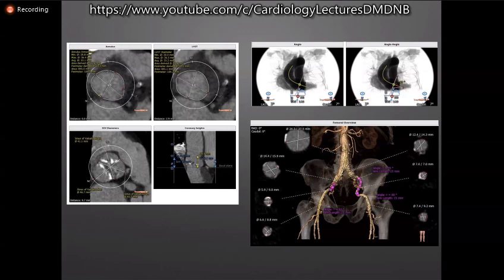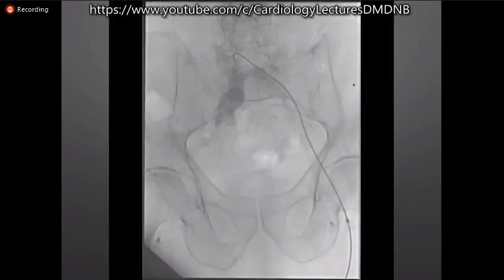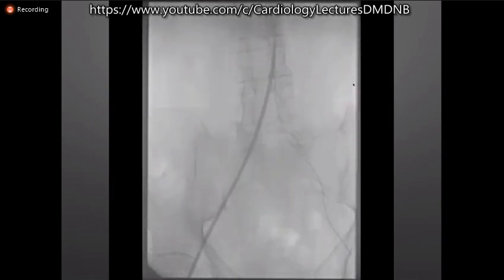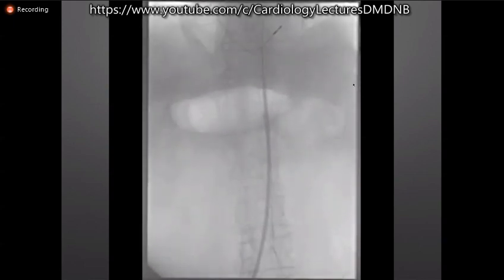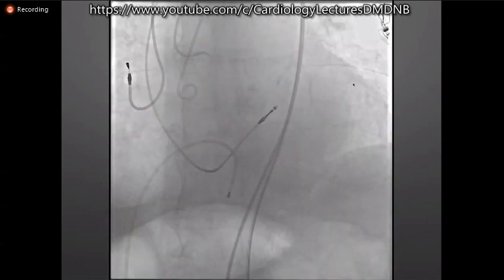Regarding access, there were some aneurysms in the iliac arteries, but nothing very serious. So we thought that we could do the procedure with MyValve 32 with plus 2 cc's in the Navigator balloon. Usually we do the punctures under echo control, but regarding these aneurysms, we thought it would be useful to do the angiogram before the procedure, just to have comparison images. So we placed one ProGlide, placed a stiff wire, and entered with a Python sheath, which is a 14 French balloon self-expandable sheath that can accept all sizes of my valve.